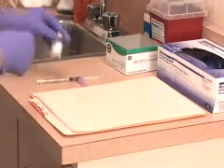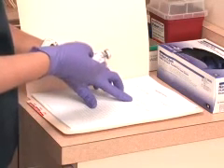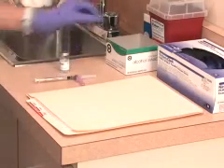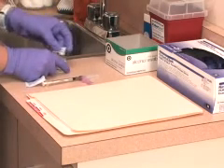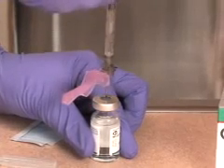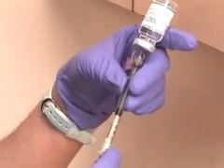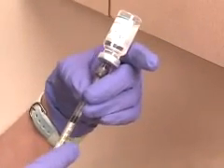Check the medication a third time against the physician's order. Remember, the first 2 checks would have been made when you retrieve the medication from storage. Cleanse the top of the medication vial with an alcohol wipe and allow it to air dry. Following standard procedures, draw up the correct dosage from the vial. Inspect the syringe for air bubbles, tap to release, and re-inject them if necessary, then withdraw more medication if needed. Remove the needle from the vial.